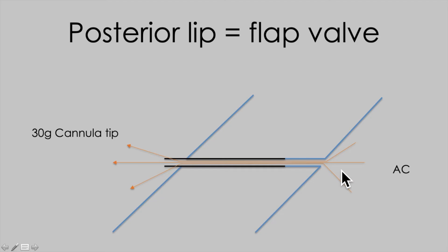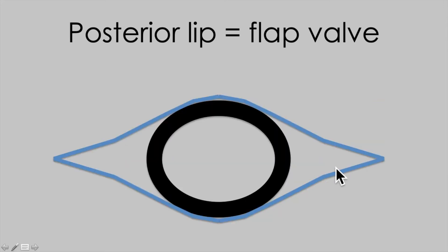If you want to allow fluid escape, just advance the cannula a little further into the paracentesis. Looking from the inside, you can see how the cannula then splints the interior aspect of the entry site open, allowing free flow around the outside of the cannula.